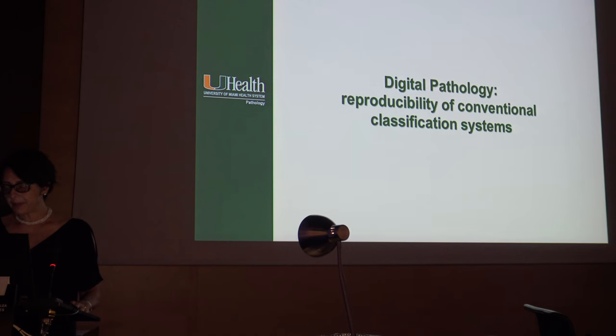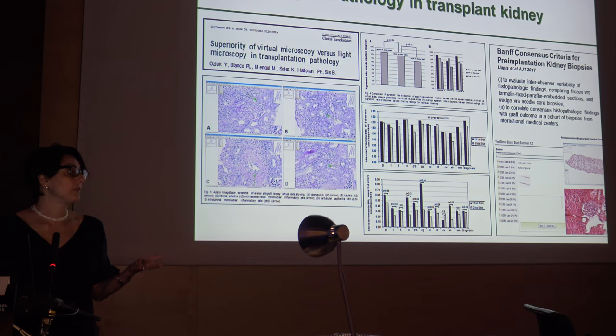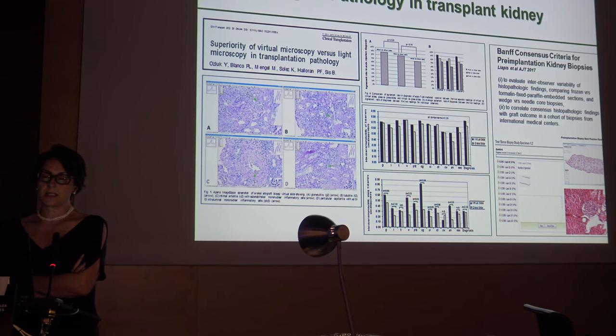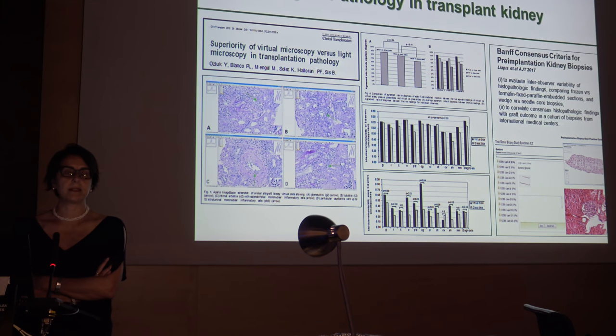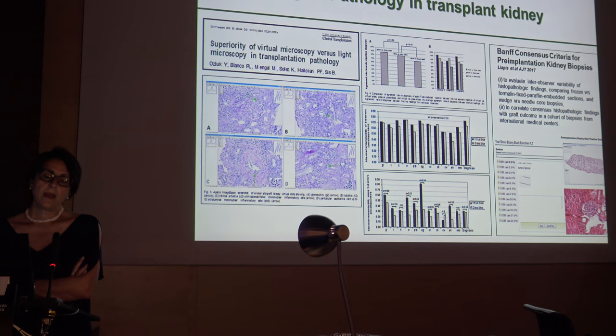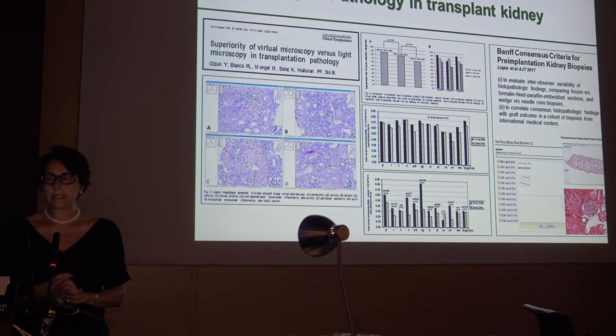So digital pathology has also been used to test reproducibility of conventional classification systems in clinical practice. And this is an example from a few years ago, but still very valid, where the investigators looked at the reproducibility of the BANFF classification and BANFF scores by digital pathology compared to light microscopy, and concluded that using digital pathology there was greater reproducibility.